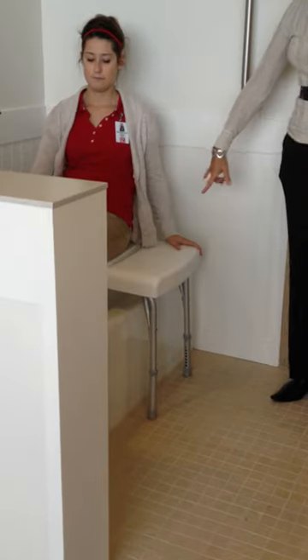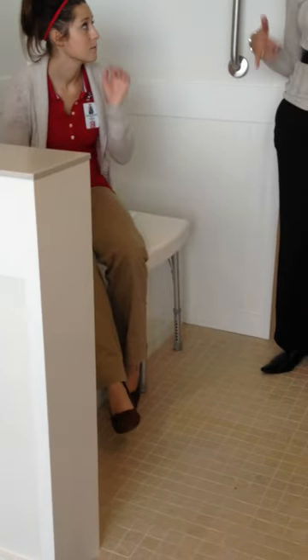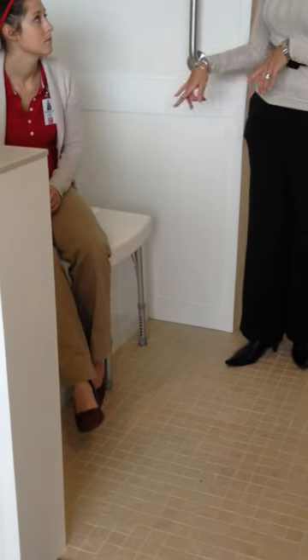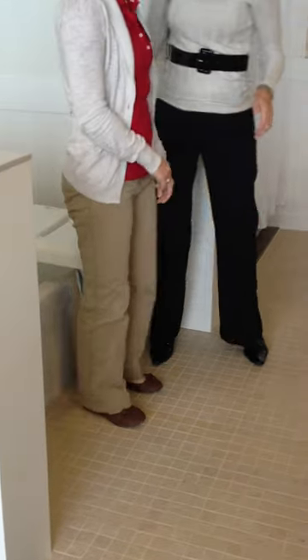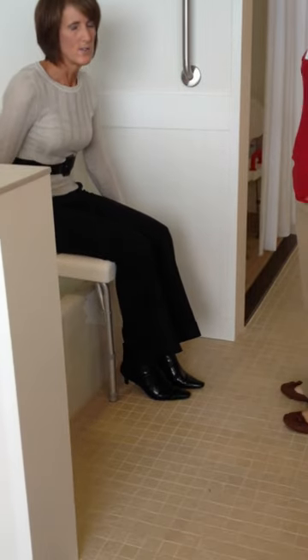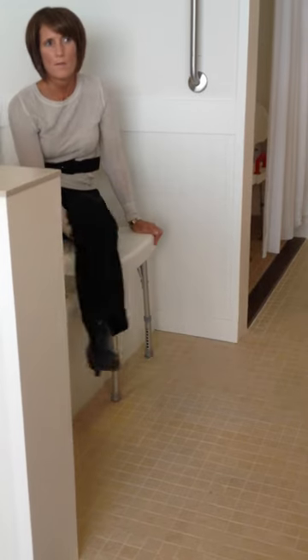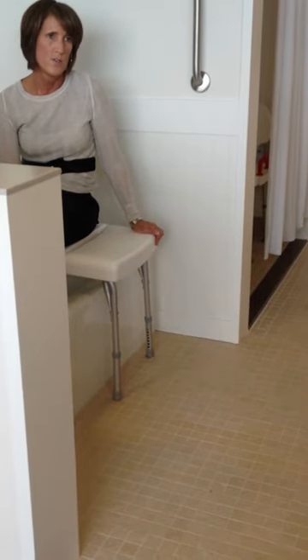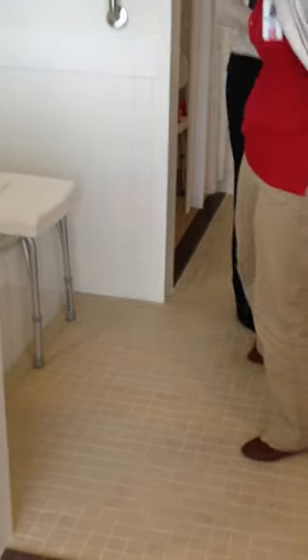You might also use this type of bench for a patient that's had a stroke who can't stand up and step in. You would do the same thing — have them sit, and if this is their affected side, they can scooch back. They should be able to lift this leg in, and they might have to use this arm to lift it up and in. If they couldn't do that, you or a caregiver would have to help them. You might also need the back on from the back of the tub. You guys want to give it a whirl?